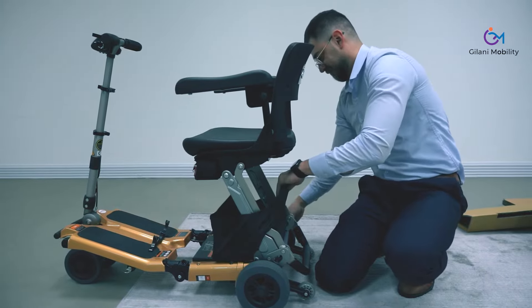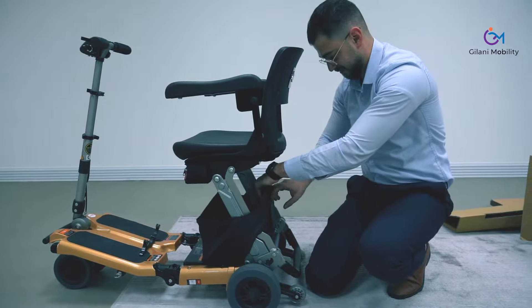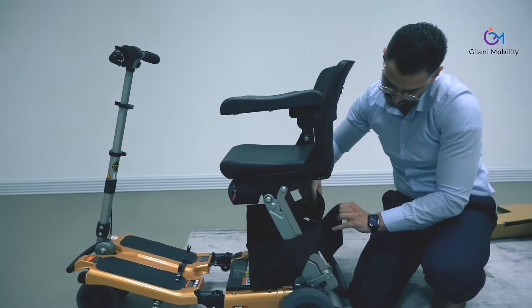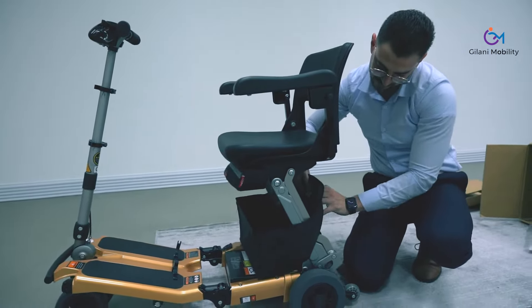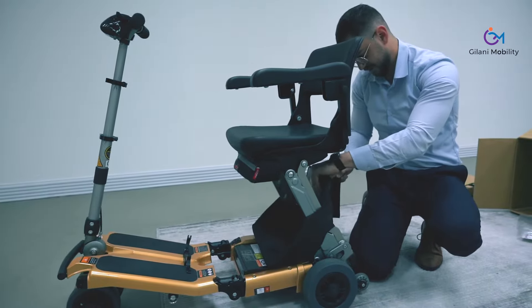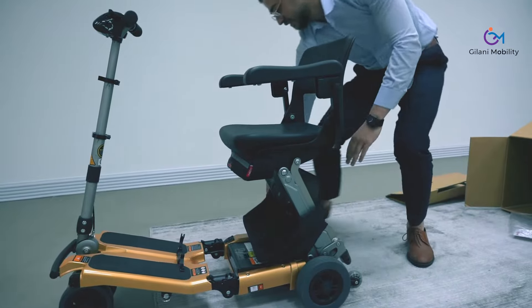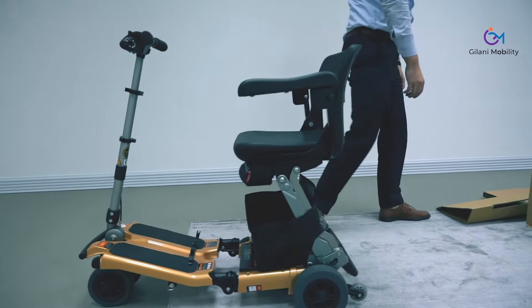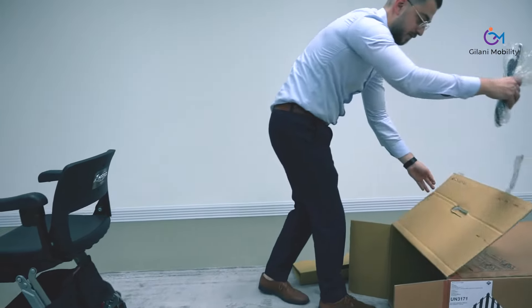The scooter being lightweight and easy to fold, you can simply unfold or fold it and adjust the handlebar and everything you need conveniently. The handlebar that was folded up can also be tilted back and forward to the angle that would be most suitable for you.